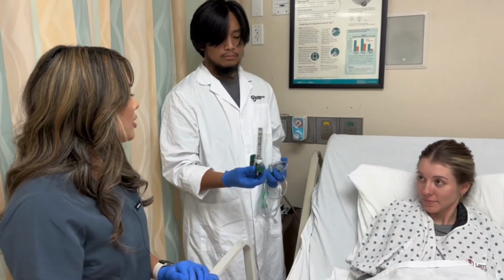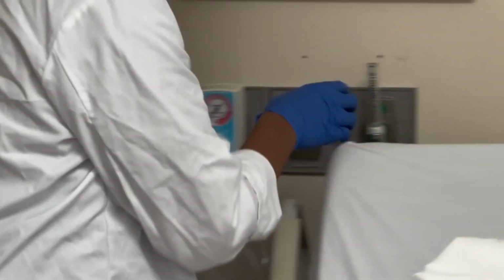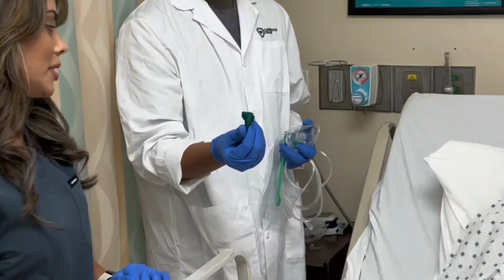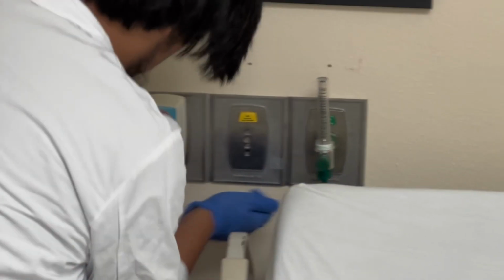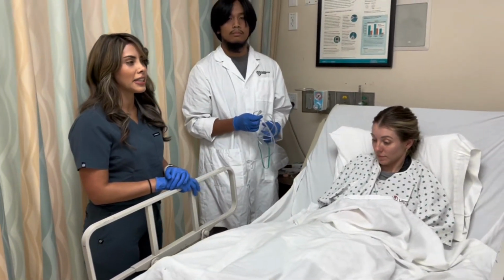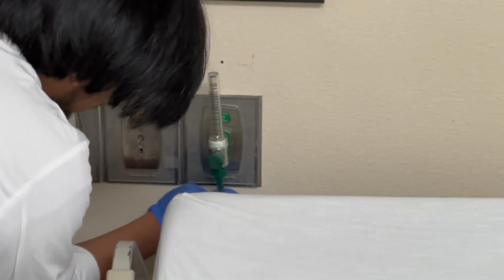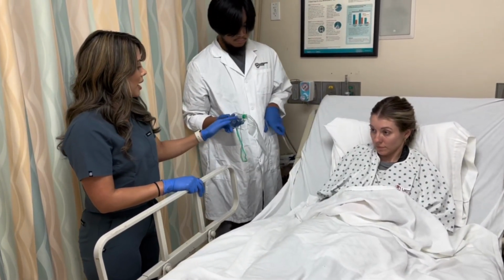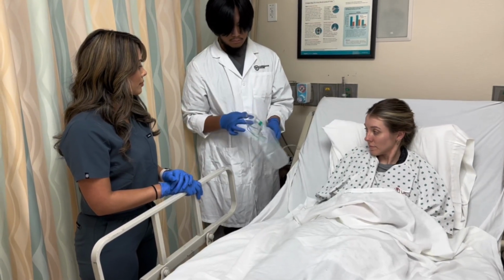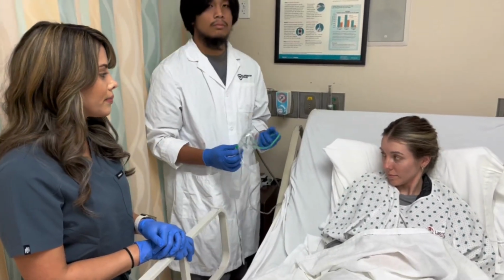And what we have here is a flow meter. He will go ahead and plug that into the wall. And we have the Christmas tree that goes onto the flow meter. And the flow range will be 10 to 15. This is the tube that gets connected to the flow meter. And this is the bag with the reserve. This is the mask with the reserve bag. And the FiO2 range will be 80 to 100.